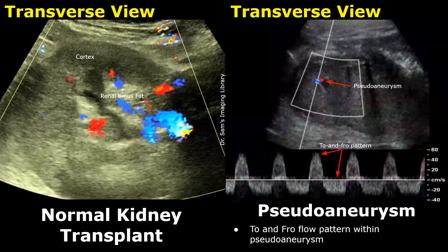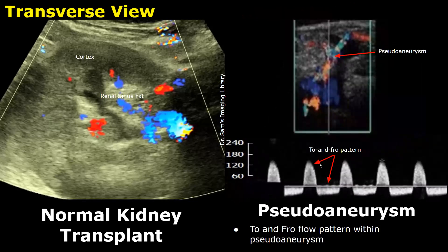This is a spectral Doppler of a pseudoaneurysm. We will find to-and-fro flow, which is an alternating forward and reverse flow — one waveform will be seen above the baseline and the next below the baseline. Here is another example of a spectral Doppler waveform of a pseudoaneurysm, showing the to-and-fro flow pattern.